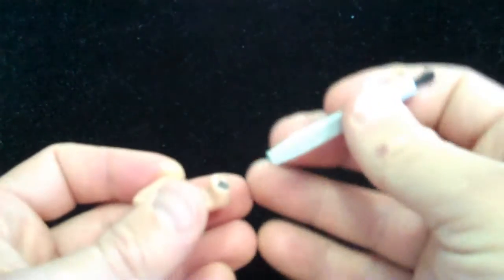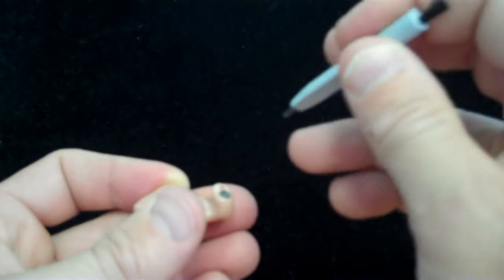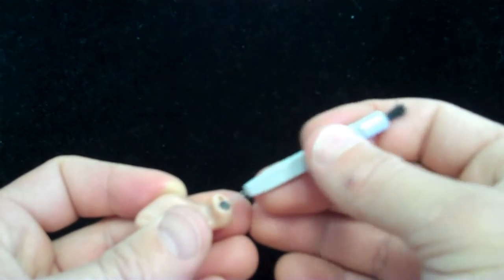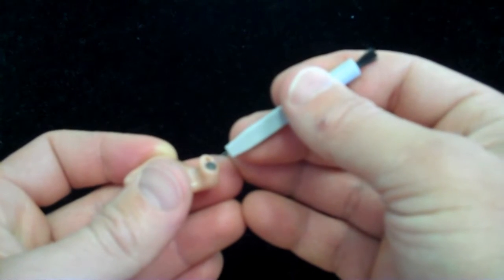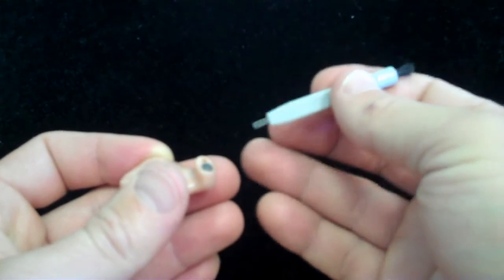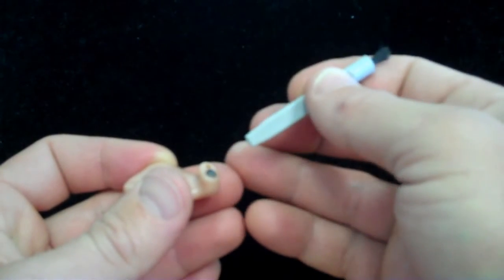So first we'll take that same wire loop tool here, and we're going to use that to scoop out the air hole. Now the receiver hole as well, some of these will often use a type of wax trap or wax guard, if you will. If your hearing aid does have a wax guard in place, you cannot clean it out with the wire loop. If it just has the open tube, feel free to scoop it out with the wire loop.